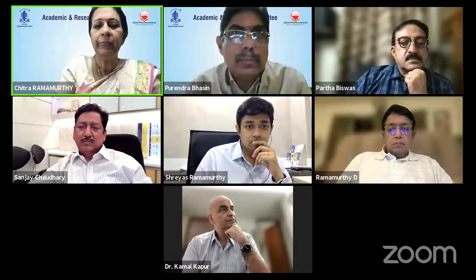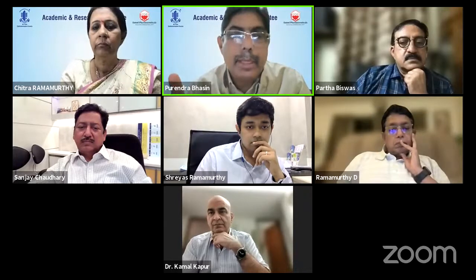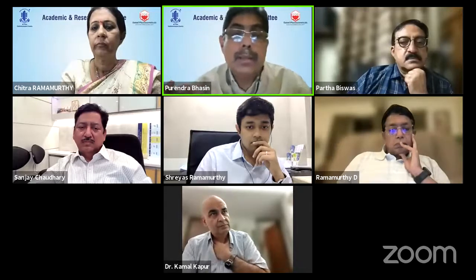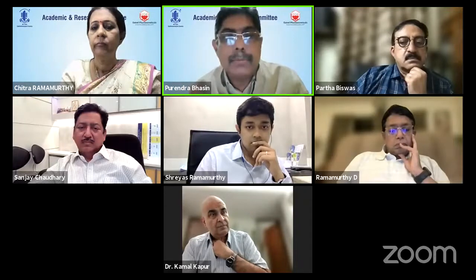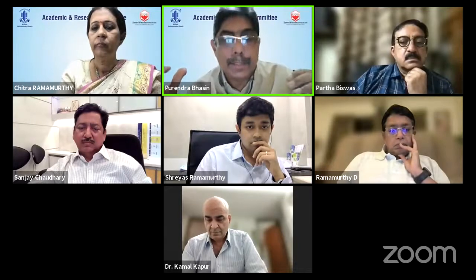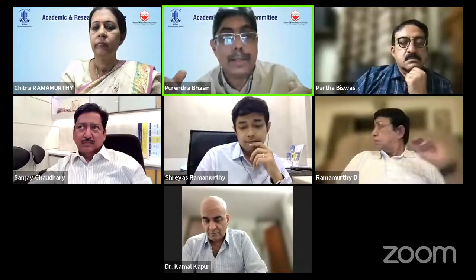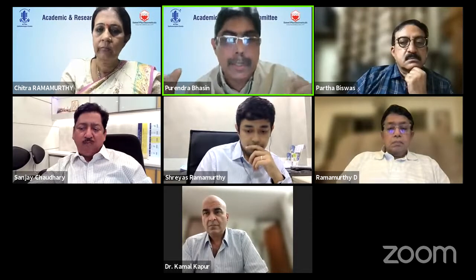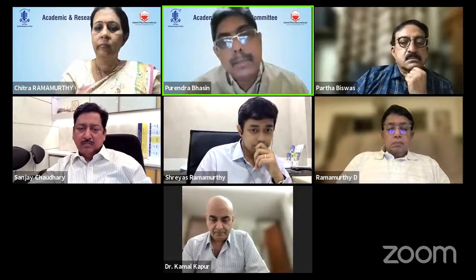Yes, Doctor, tell me. In a 100 micron vault, what I do is I dilate people fully and do Pentacam and Scheimpflug imaging and see the vault, because sometimes what I have seen is that with a low vault there is a peripheral sagging of the lens. So it touches the crystalline lens in the mid periphery. If the vault is further reduced in the mid periphery, then I will explant it, and we will see for the development of cataract.